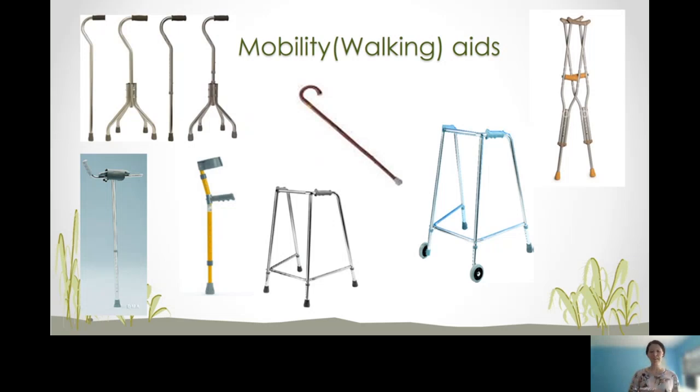Next to it on the right side is a walking stick. I'm sure you've seen that some of your grandparents or family members, even in your community. People are often very fond of their walking sticks and have all kinds of decoration and special wood, very handy. At the bottom of the cane or the walking stick, you will see the rubber casing that needs to be intact.